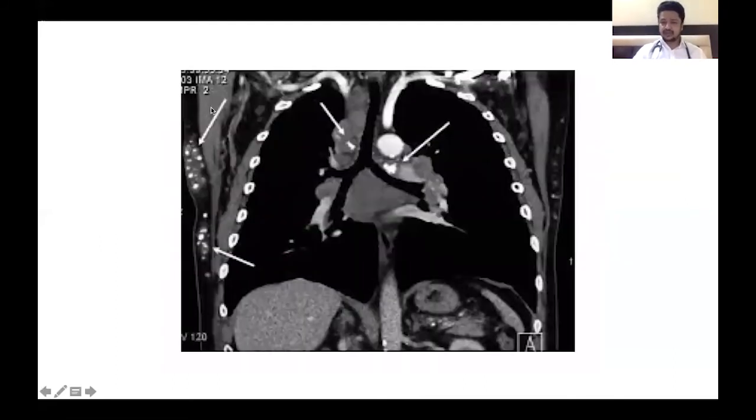So, like we introduce the bronchoscope here. We see on the ultrasound, and we are able to see all around. So we can make out our lesion, and then we can introduce the needle into the lesion in real time via EBUS. This is the one thing.